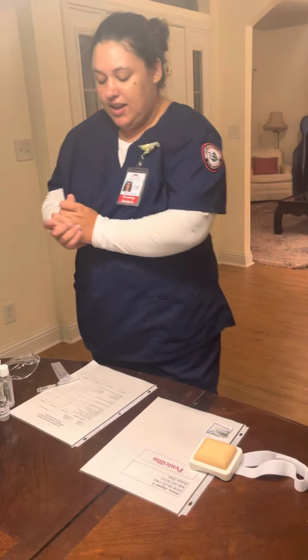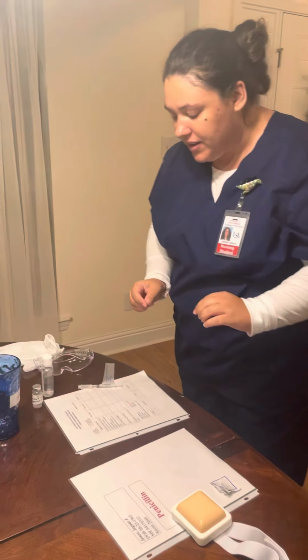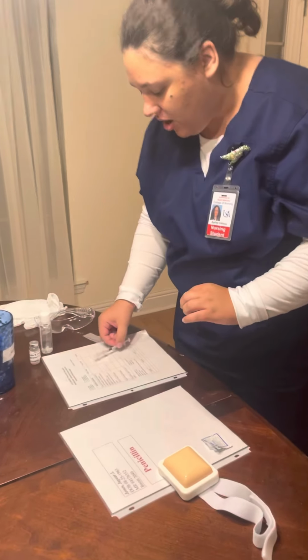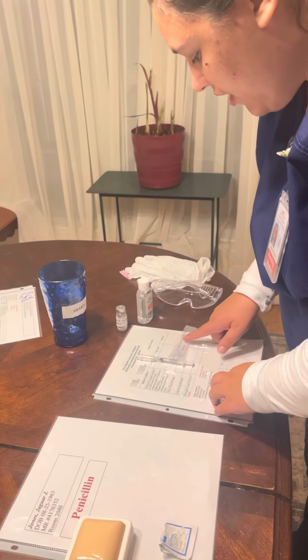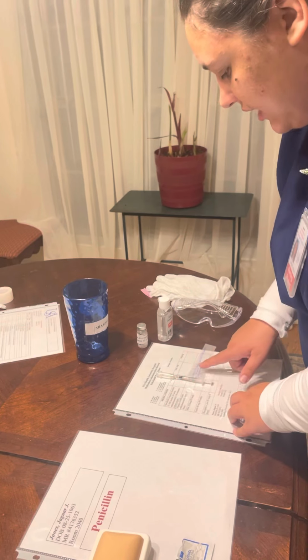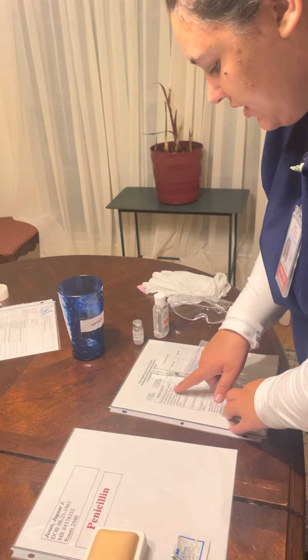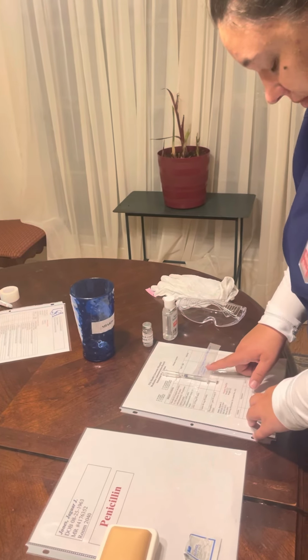I'm gonna perform hand hygiene. And I'm going to check my MAR again. So, Novolin R regular insulin U100. 10 units, subcutaneously 30 minutes before meals for the control of diabetes. Jaguar Jones.